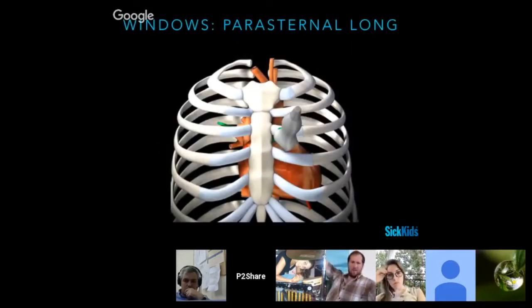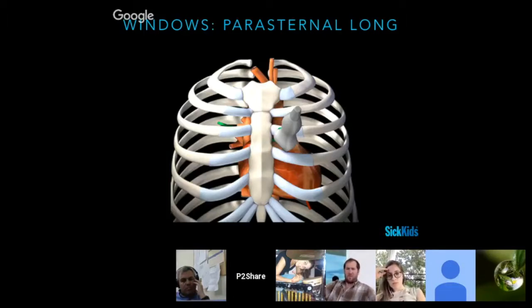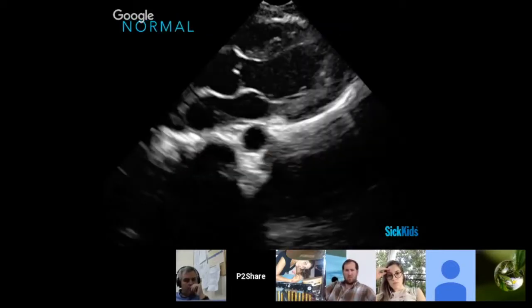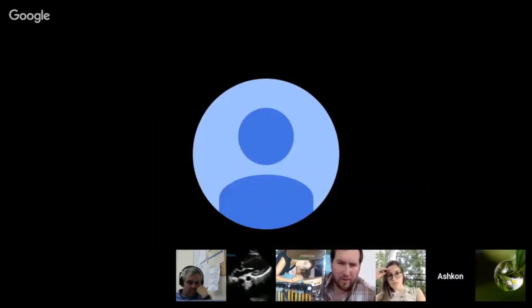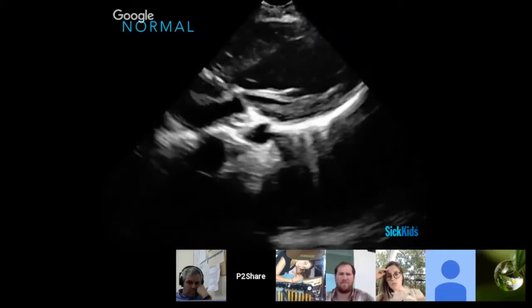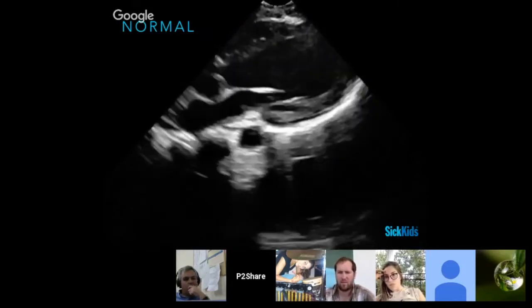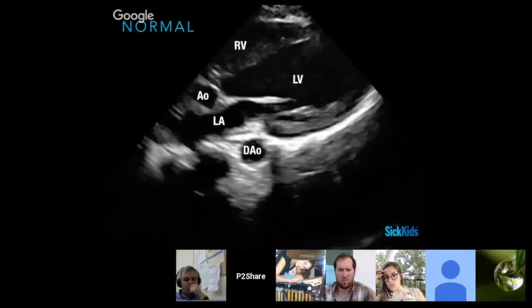Next we're going to talk about the parasternal long axis. The probe is generally in the second to third intercostal space, but really this is one of those things where there's no right or wrong place — there's the view you're looking for. The biggest challenge with cardiac is that people get fixated on where the probe has to be, when really, when you get good at cardiac, you start learning how to tweak the probe to get your views when the patient's anatomy is less ideal.